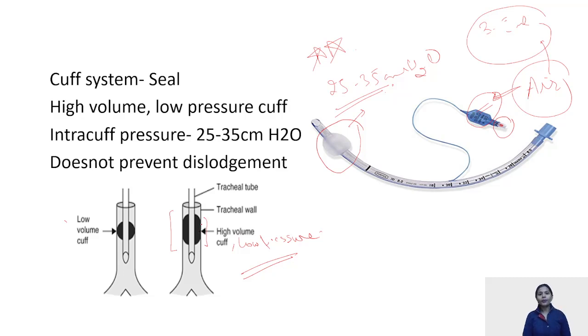Thus, there are lesser chances of tracheal mucosal injury because the pressure exerted on the tracheal wall is less.